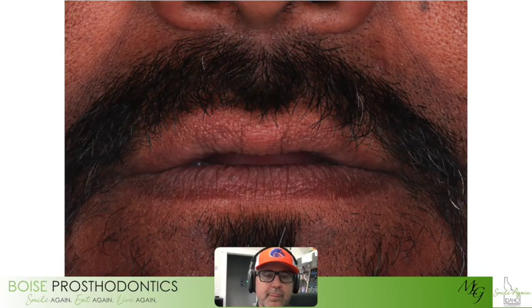So here's how we do it. You'll take this picture with their lips relaxed and apart. Some people call it in repose. And we measure that lip length. There's an average lip length for most men and women. Helps us better identify if the teeth are in the right position. Then we'll see if any teeth are visible. And in this case, you only kind of see that little tooth right there, which will play a role in how we determine what we should do in this person's case.